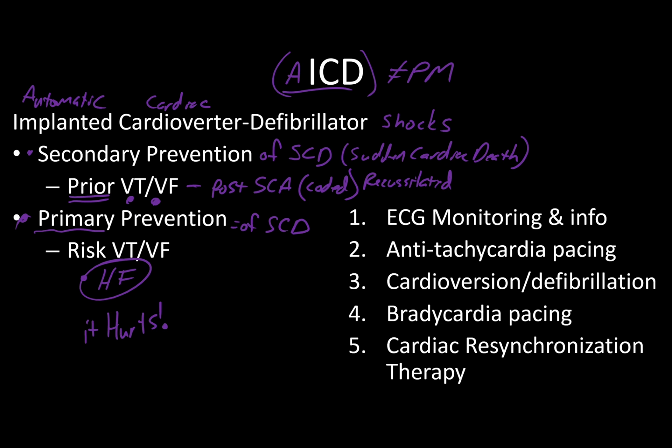And so the most important advice I can give you for patients who have an AICD that may be firing: do not hold their hand, because you'll get shocked too. In fact, I had a patient who wound up coding, and we were doing compressions, me and another nurse. He went down right in front of me.